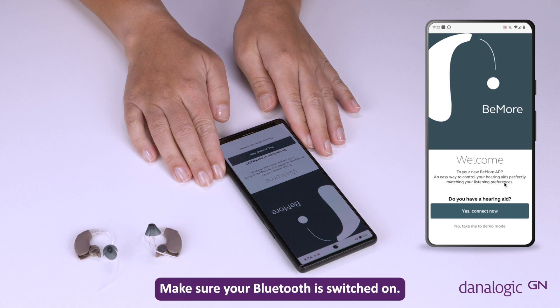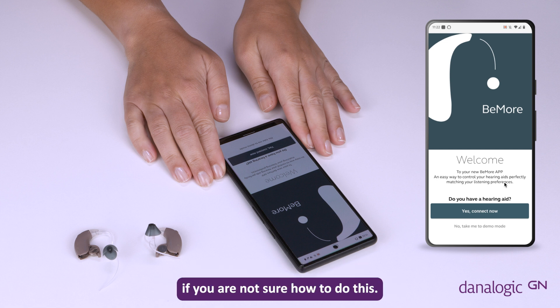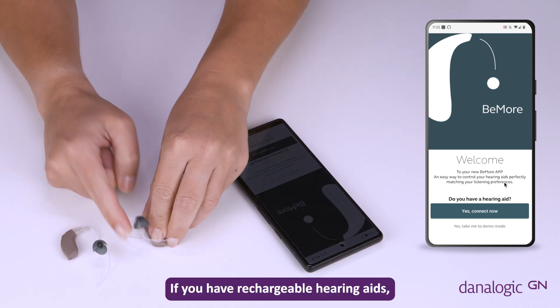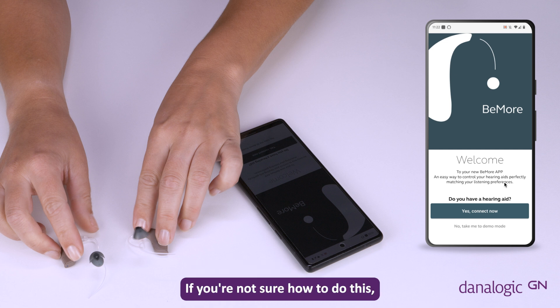Make sure your Bluetooth is switched on. Please refer to your phone manufacturer's guide if you are not sure how to do this. Switch your hearing aids on by closing the battery doors. If you have rechargeable hearing aids, restart them when instructed using the push button on the back of the hearing aid. If you're not sure how to do this, please see the relevant video.